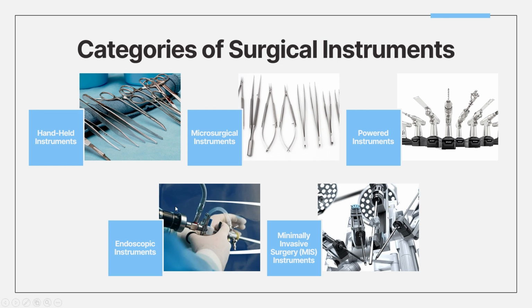In that case, they would also be known as minimally invasive surgery, which includes trocars and scopes, as mentioned, for small incision surgeries. Usually, they're also robotic assisted, like the Da Vinci systems here.